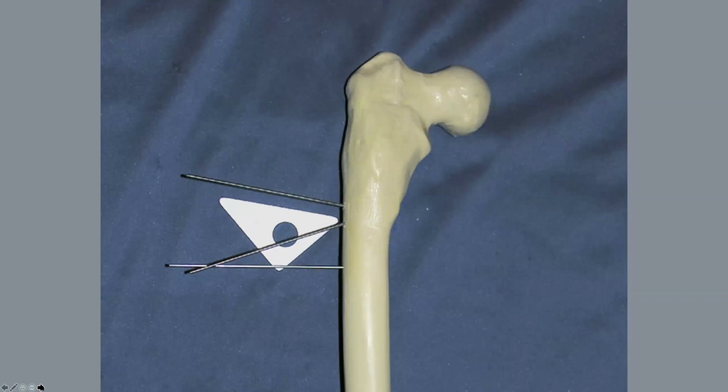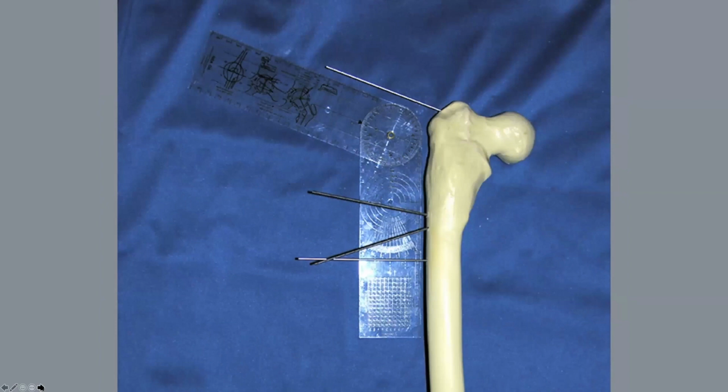So again, you need the bottom pin to guide one cut, second pin to guide the second cut. And usually what I'll do is the second pin that I'm putting in for my second cut, I'll reference that off of the first pin that I put in, not the 90-degree pin, but the first pin that I put in for guiding my lower cut. And that is, in case I've made an error at all in that placement of the first pin, I still have exactly the size wedge that I want to remove, right? You're not summating error as you go along in that case.